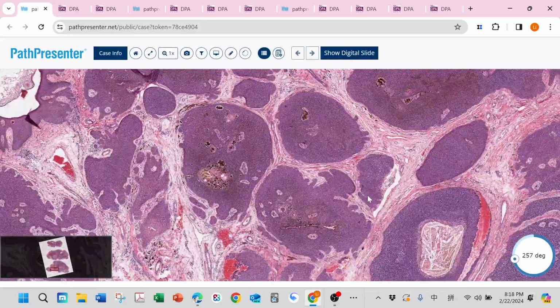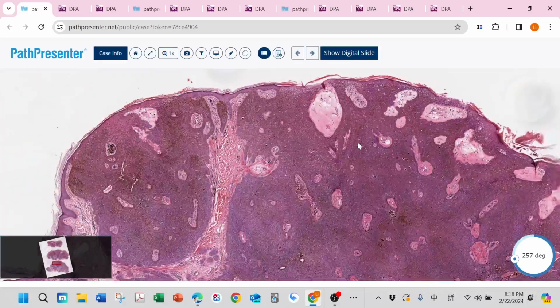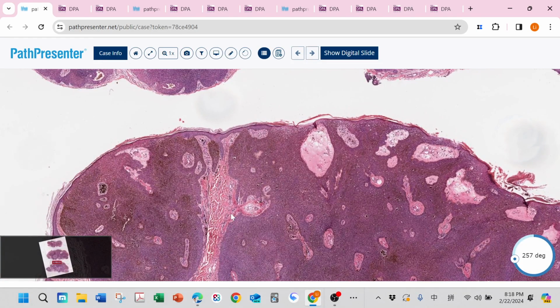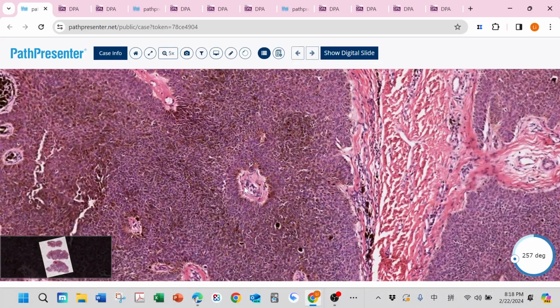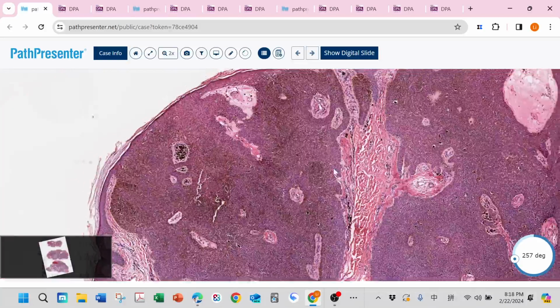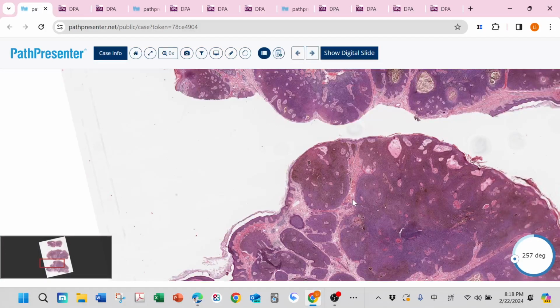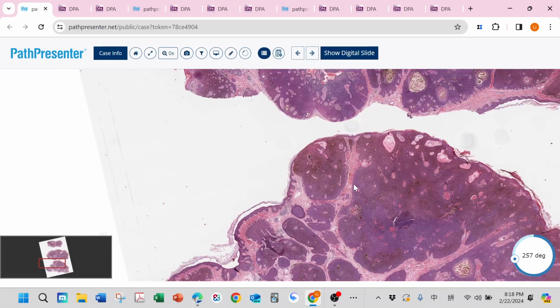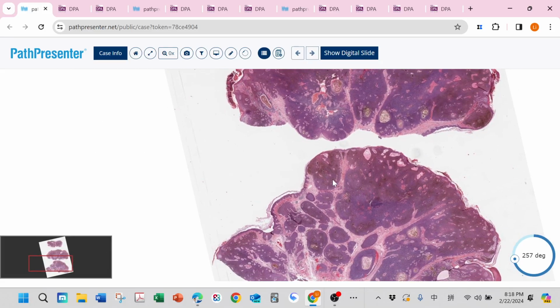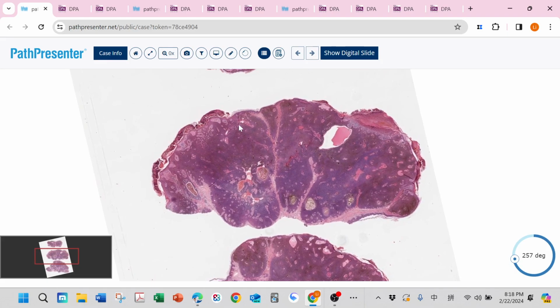But if we have multiple connections to the epidermis, monotonous cells, and this poroma stroma with dilated blood vessels, this one is poroma. Combine two of these features, that is acrospiroma. But I don't think it is wrong to just call it poroma for this entity.